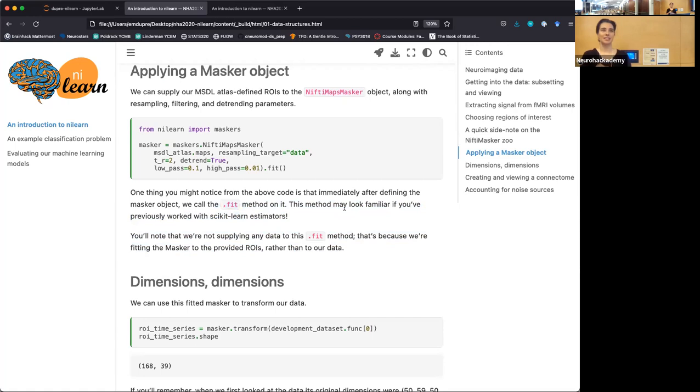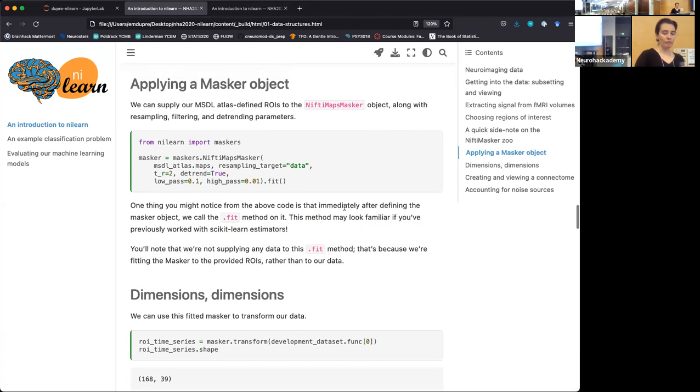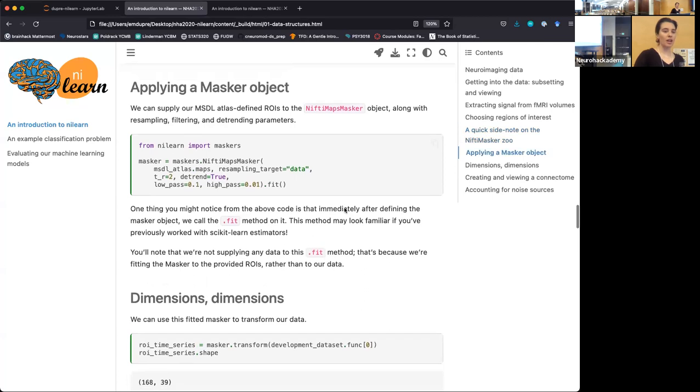So yes. This is maybe technical, but so you're extracting the mean time series from the ROIs and then doing your filter? No, you're doing the filter and then extracting. Okay, so it does it on a voxel-wise basis first? Oh, that's cool. I think so. Yeah, I believe so. We can double check that. But do people care? I don't know. People do care.